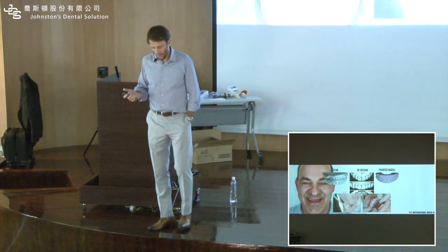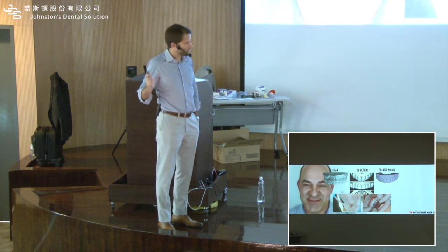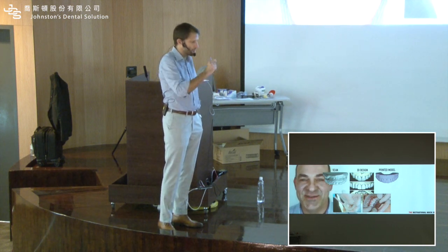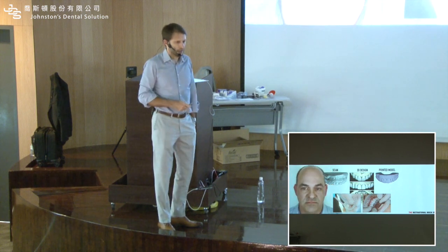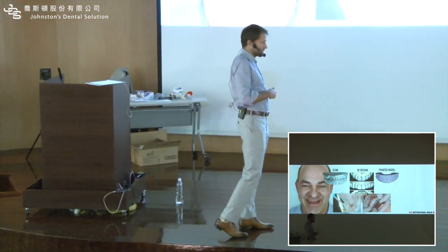So the patient may ask, but does that hurt? No, it's over your teeth, in and out. I don't touch your teeth. No need for anything. How much does it cost? We don't charge for that. It's part of the process. We're going to put it in your mouth. No cost. Doesn't hurt. Doesn't take time. So patients usually say, why not? And we're going to take some nice pictures and you will enjoy it.